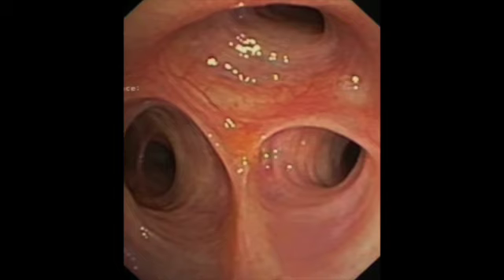Keep in mind a textbook perfect Mercedes sign versus common variations you may find in your patients. Now that we have found the right upper lobe through the tracheal lumen, we're going to remove the bronchoscope and replace it into the bronchial lumen.